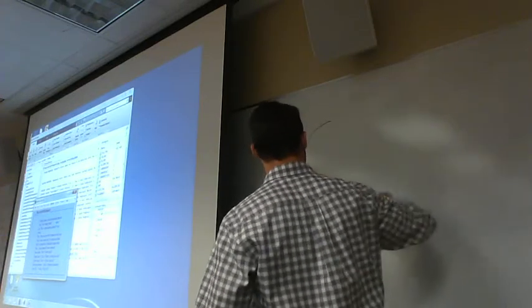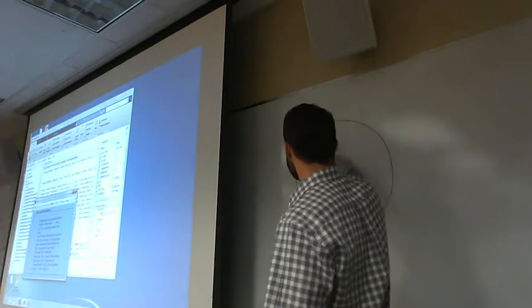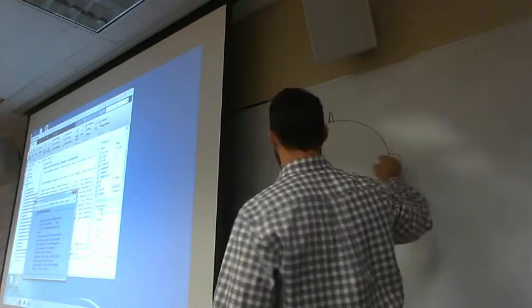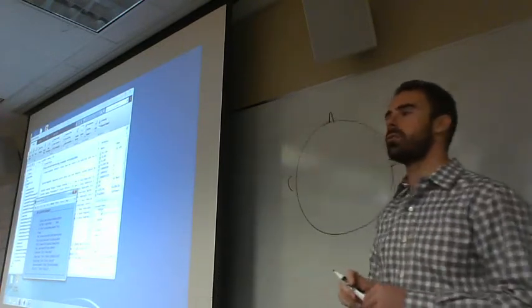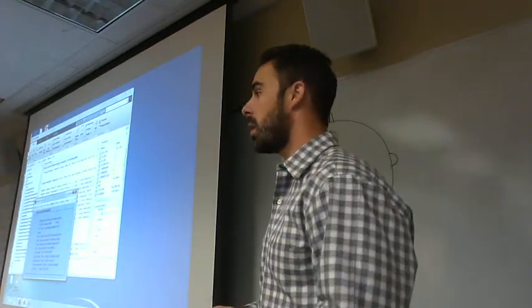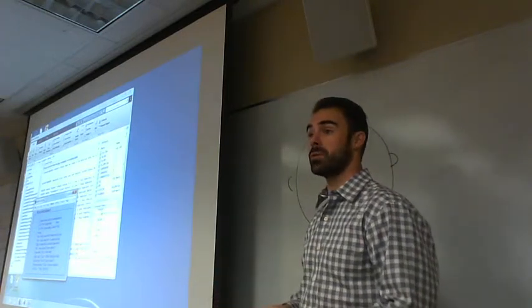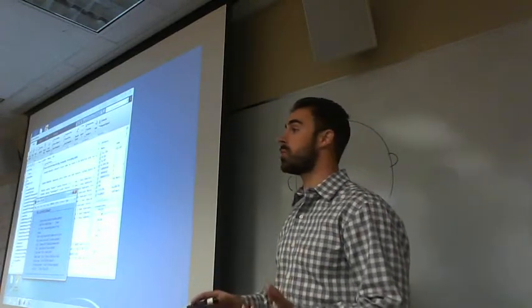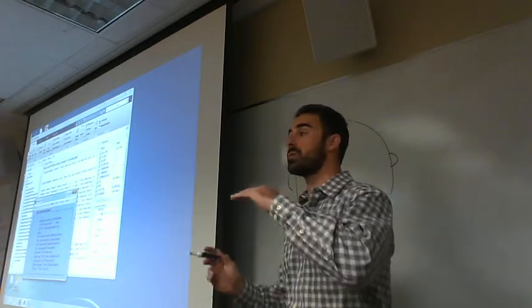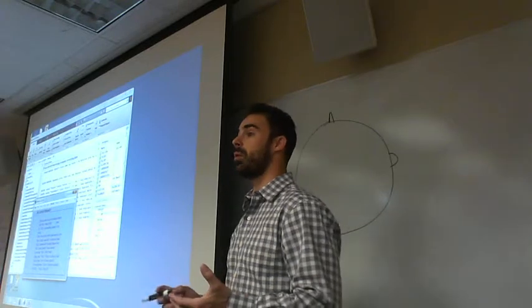So here's our scalp. We're looking down from a bird's eye view, which means that we have a nose up here, a left ear, and a right ear. We have 32 channels of electrodes recording neural activity that we would like, and we have some other supplemental electrodes helping us sort out some of that signal from noise. Now the International 10-20 system is a coordinate system, kind of like GPS or latitude and longitude, that allows us to identify what electrodes are what.